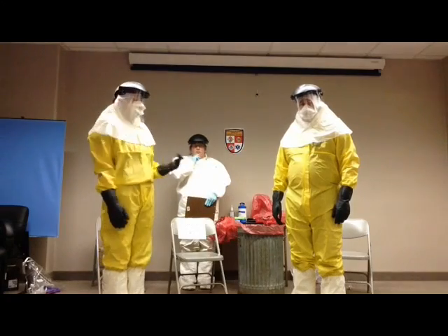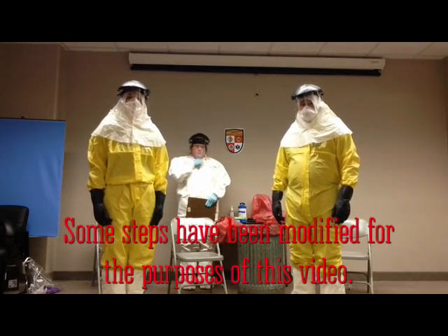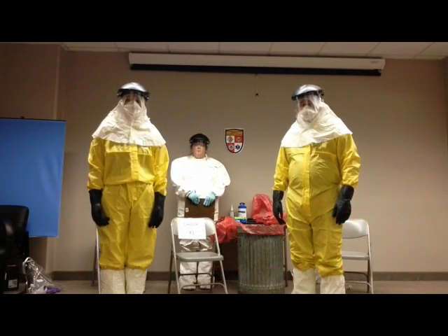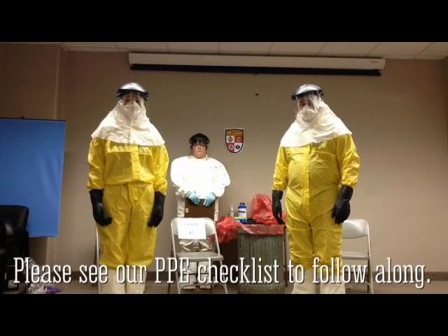I'm Kathy Peters. I'm Naomi Maddox. And I'm Bobby Combs. And today Naomi will be our trained observer. She'll be reading us our instructions from our PPE checklist to walk us through the proper doffing of our PPE.